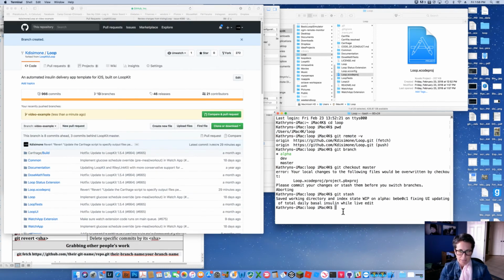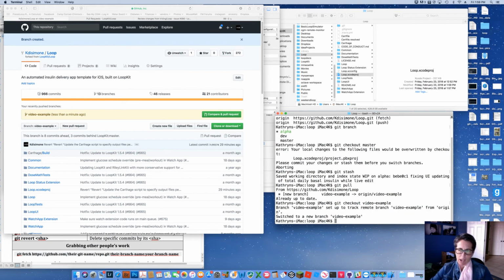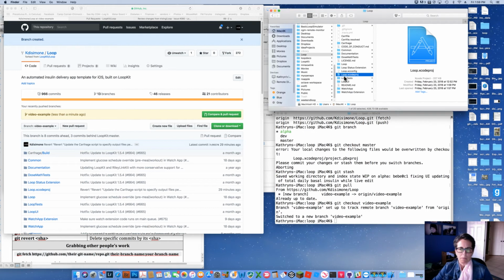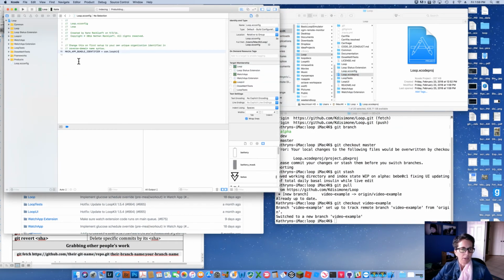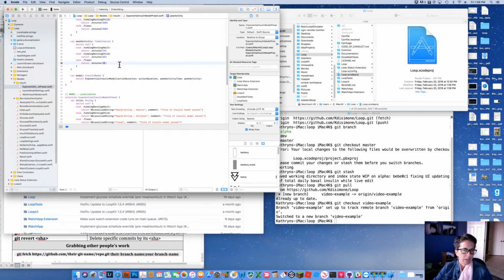So if I go over here to my Git repository local, my local computer side, and I say git pull, it's going to go over to my GitHub account and say, what's changed? Has anything changed? It says, yeah, Katie added a new branch and it's called video example. Ooh, cool. I want to go over and check out that new branch. I'm going to go check out video example. Sweet, I'm now on video example. So if I go to video example and I open it up, let's say I want to make some customizations. Maybe I want to change my peak insulin time to 75 minutes.